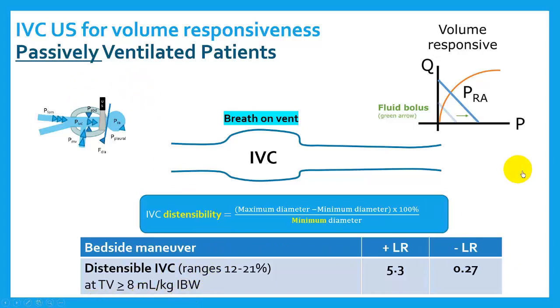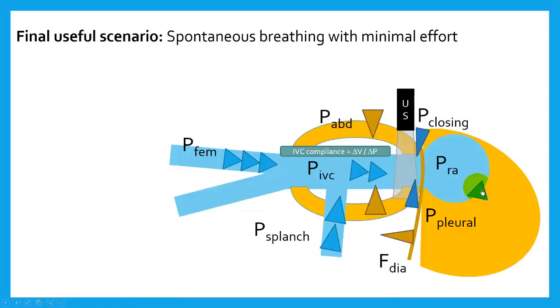I don't see that very often. So this is a potentially useful scenario, but not one we see very often. Here's the final useful scenario.